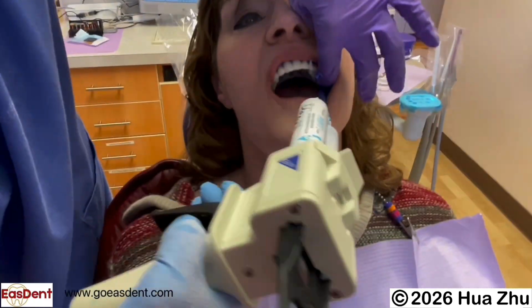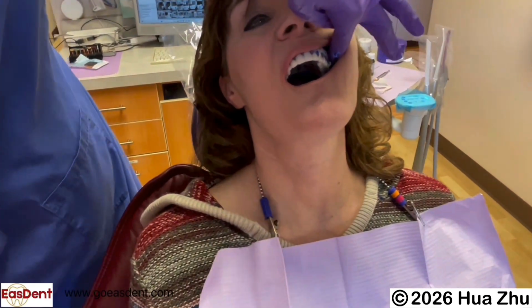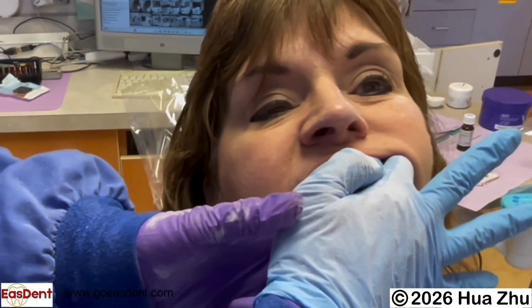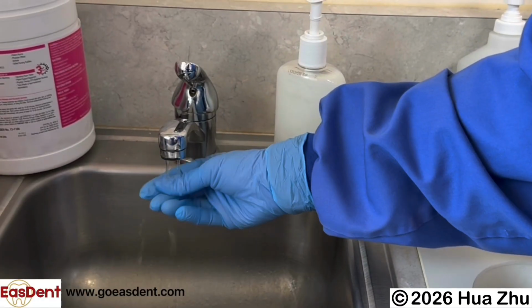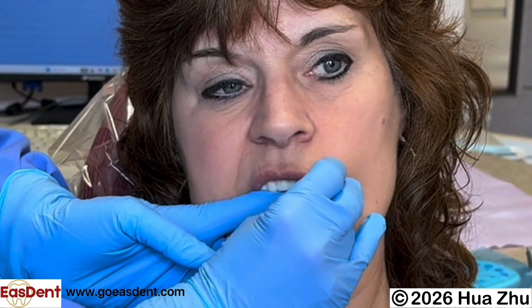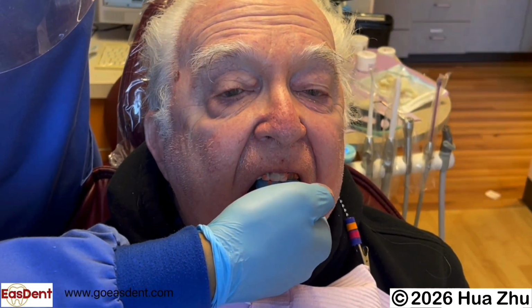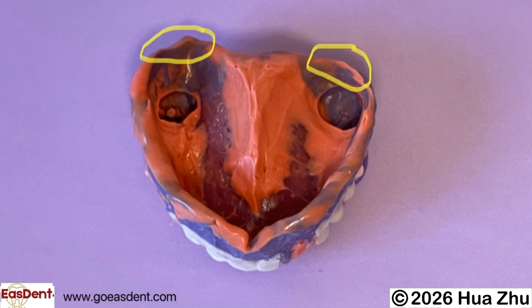If you see any border is short, add more heavy body PVS material immediately. Press the heavy body PVS material against into the buccal vestibule area. If the material sticks on your finger, you can wet your finger first or use the cheek to push the material up. Mold the border with various lip movements. It is easy to miss the hamular notch areas and the distal buccal vestibular areas for maxillary arches.